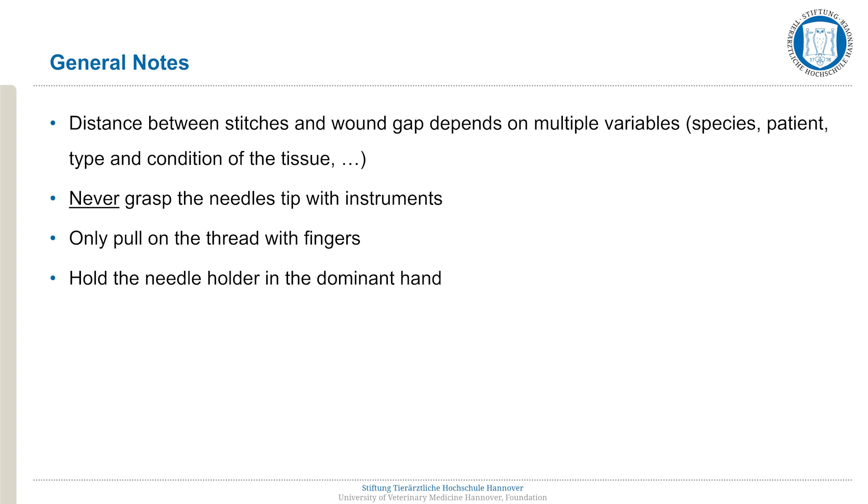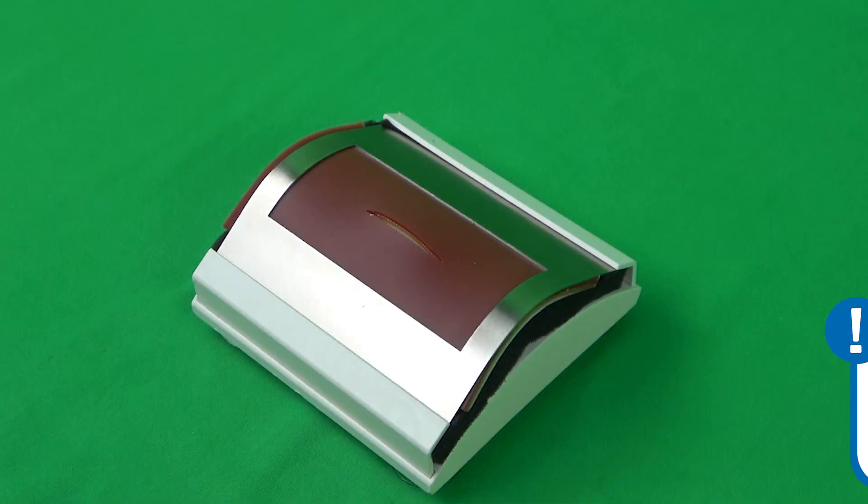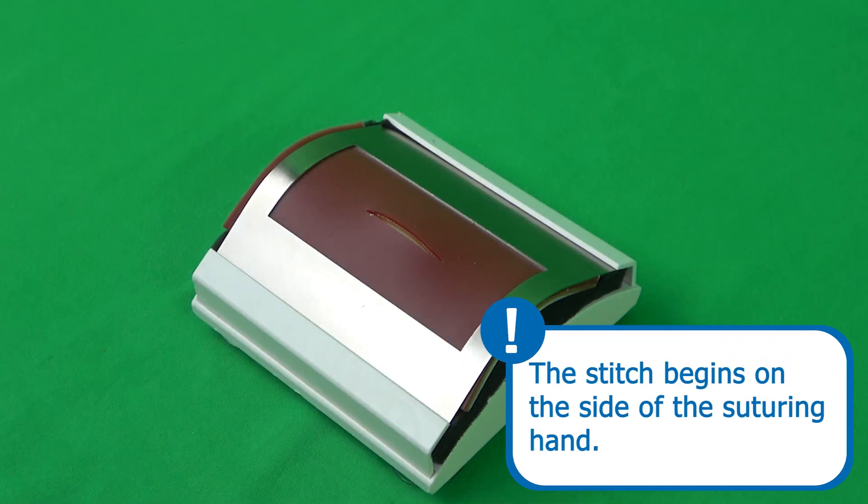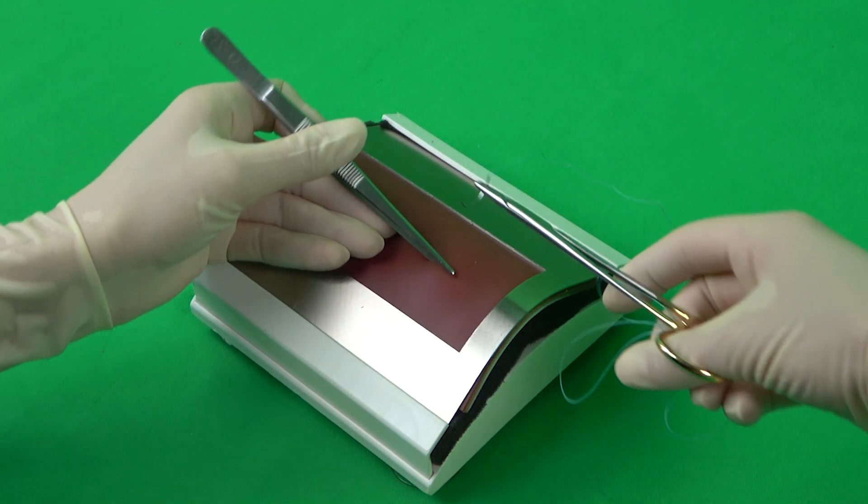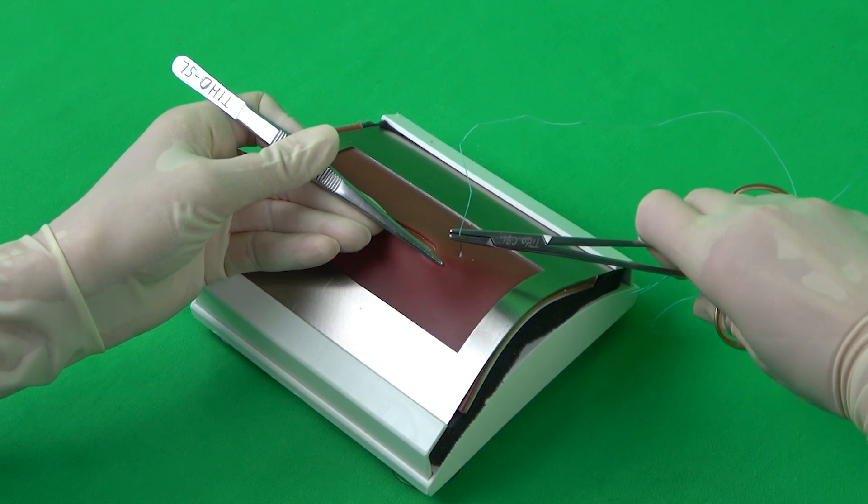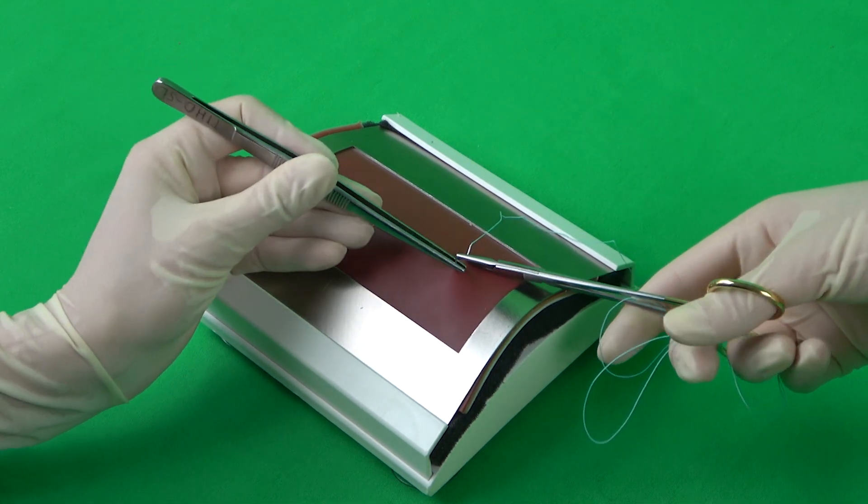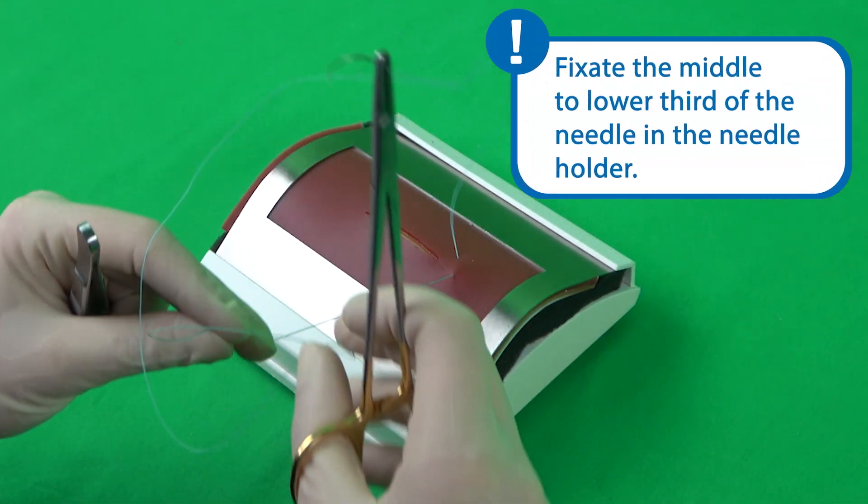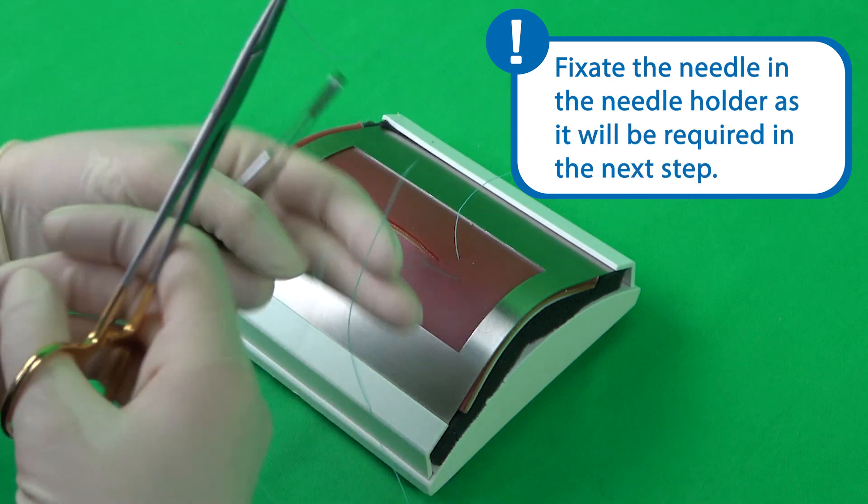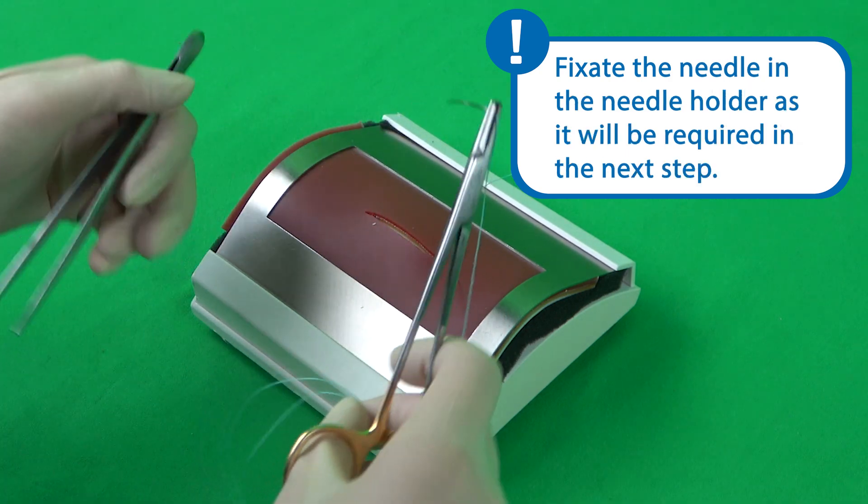The needle holder with fixated needle is held in the dominant hand, with the remaining thread collected in the palm. A right-handed suture will be demonstrated here, beginning on the right side of the wound. In the first step, a V-shaped perforation is created into intact tissue outside of the wound gap. The points of both V's point away from the wound itself. For this, the tissue at the wound's edge can be lifted with forceps, and the needle is driven from outwards to the centre through the serosa and muscle layers. The needle is grasped with forceps and can be placed into the middle to lower third of the needle holder.